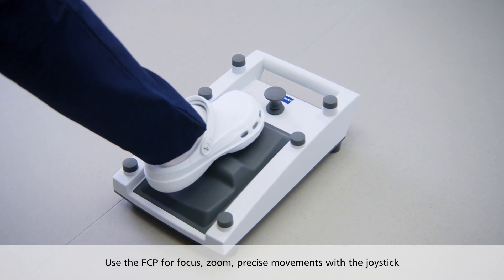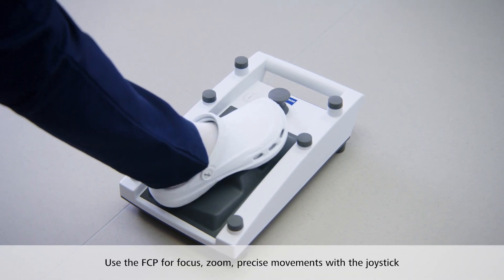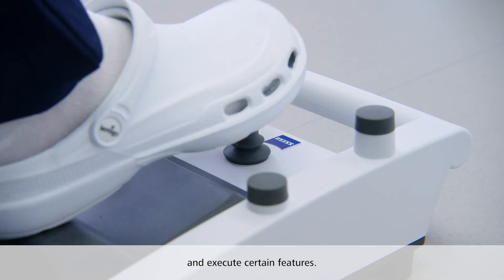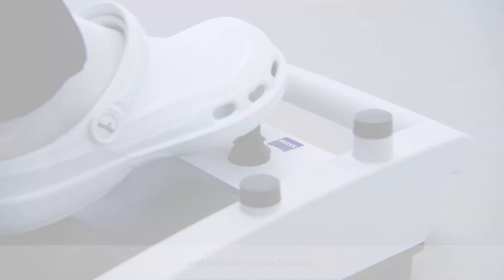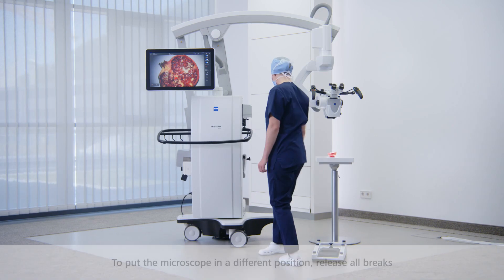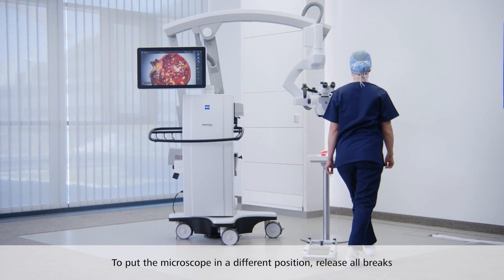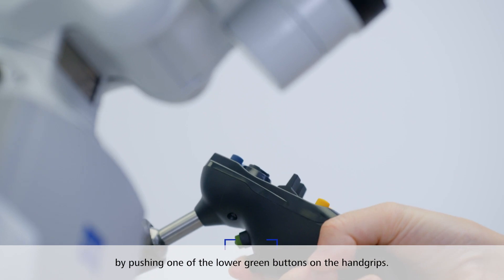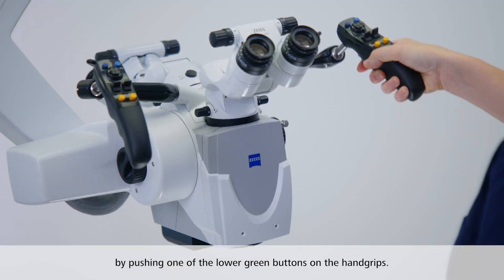You can now use the foot control panel for focus, zoom, precise movements of the device with the joystick, and to execute certain features. To put the microscope in a different position, release all brakes by pushing one of the lower green buttons on the backside of one of the hand grips.